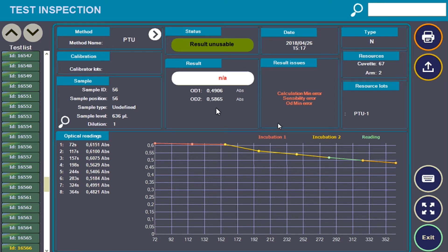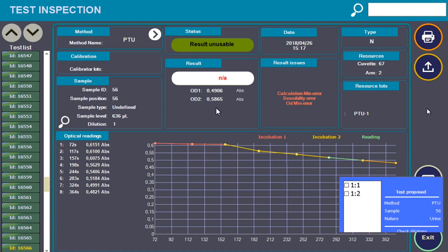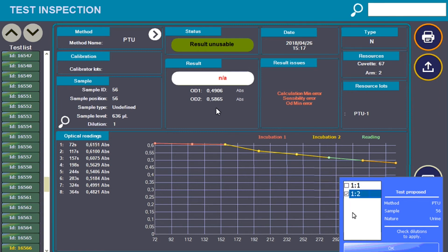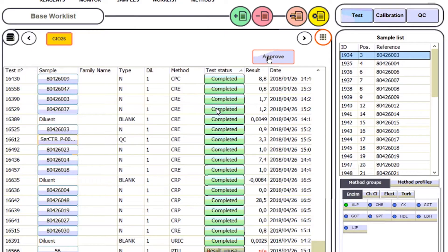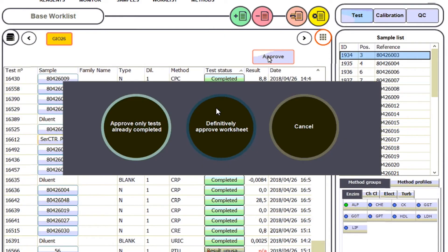Operators can verify or perform repetitions in automatic dilution for tests outside the rating range, recalculate a test using a new calibration curve, export reports to files, or validate the results to be sent to host.